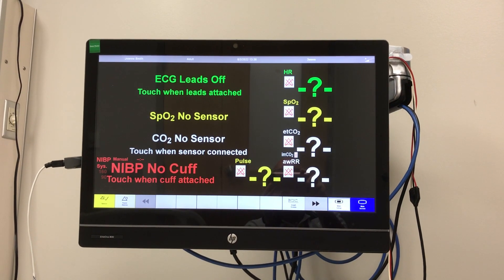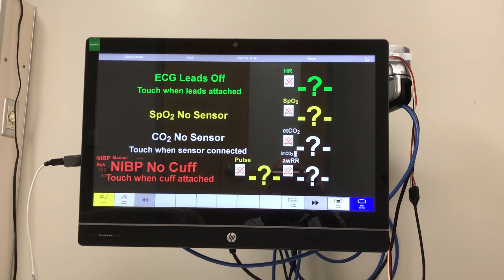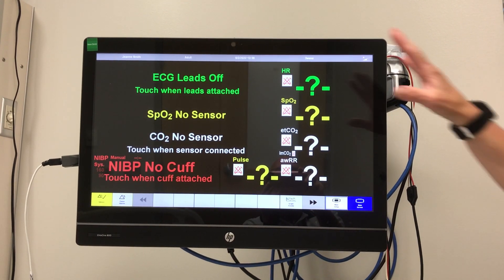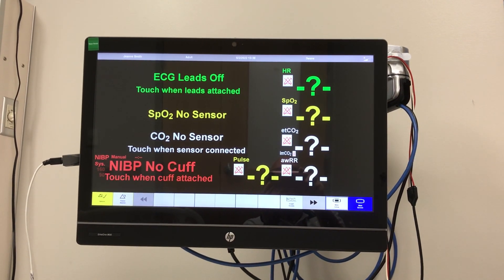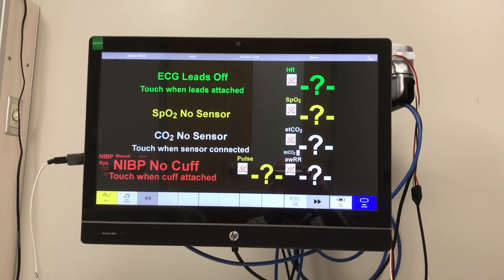Hello, welcome. We're going to go over the simulation monitor today. This is what the monitor is going to look like when the simulation starts.